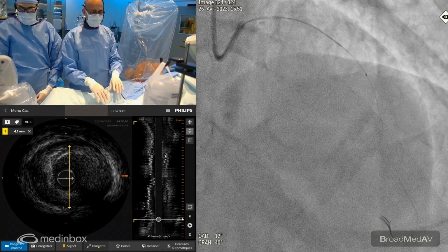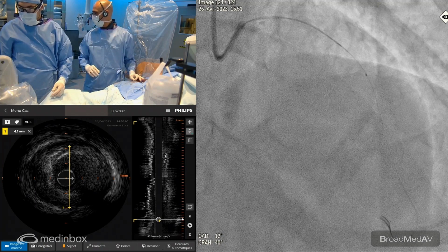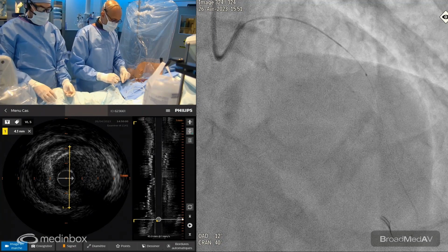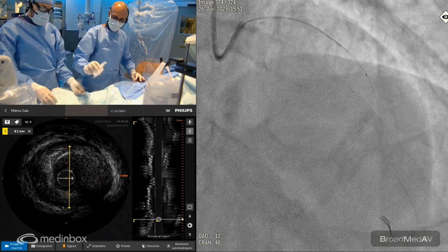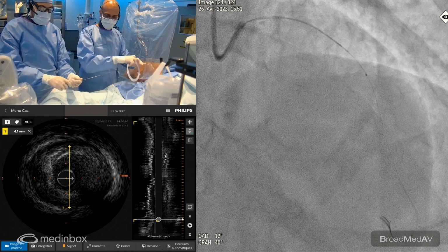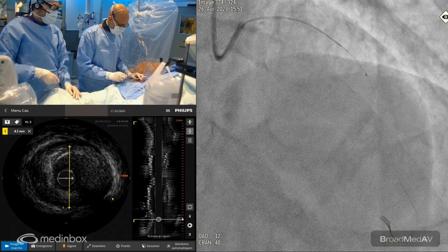Let's take the microcatheter and a 2.5 balloon for trapping. So safest way, in my opinion, is to deliver a workhorse distally and have a microcatheter. And since we did the IVUS first, the microcatheter wasn't uploaded. So now we'll perform trapping of the wire to be able to bring up the microcatheter safely. So trapping in a 7 French, you ideally need a 2.5 balloon. You bring it up to the distal tip of the guiding and you inflate.